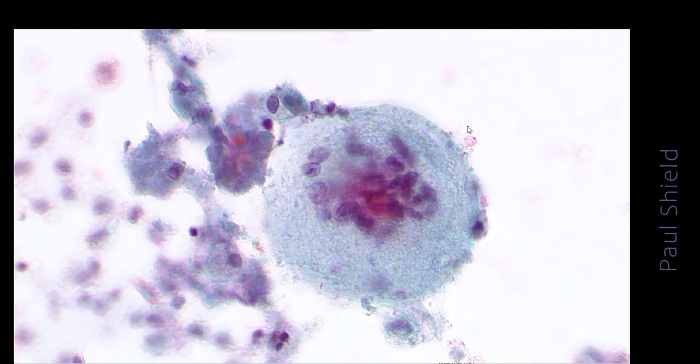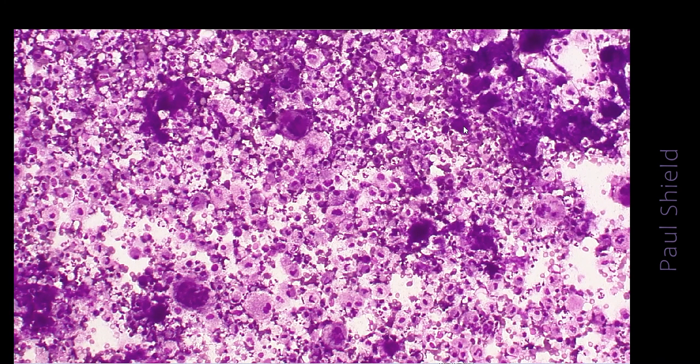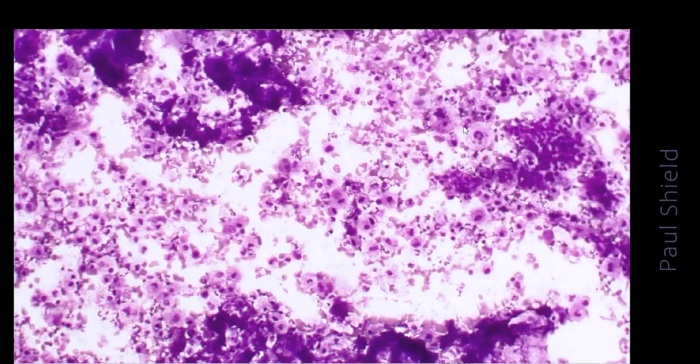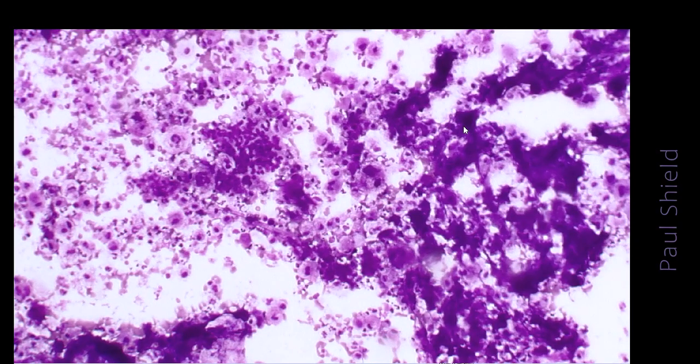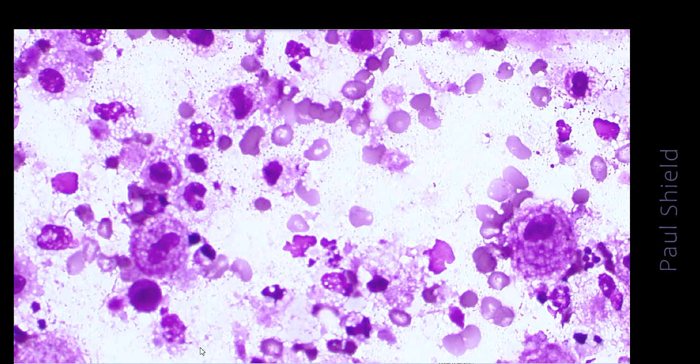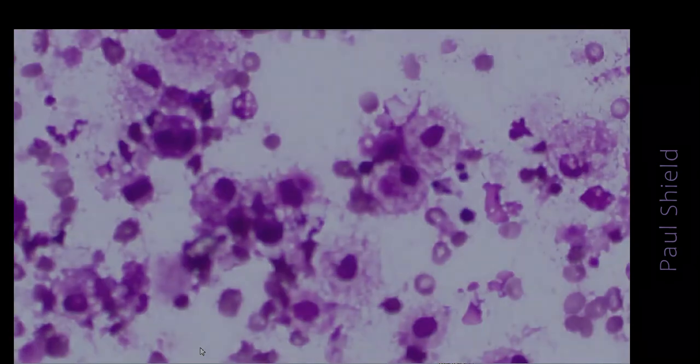So you generally see very few mesothelial cells, if any, in these specimens. The entire specimen is made up of debris, of macrophages, and of giant cells. On the air-dried slide here, you can see the same findings really. Just a high power on the air-dried, nice macrophage morphology with very foamy sort of cytoplasm, some ingested material.